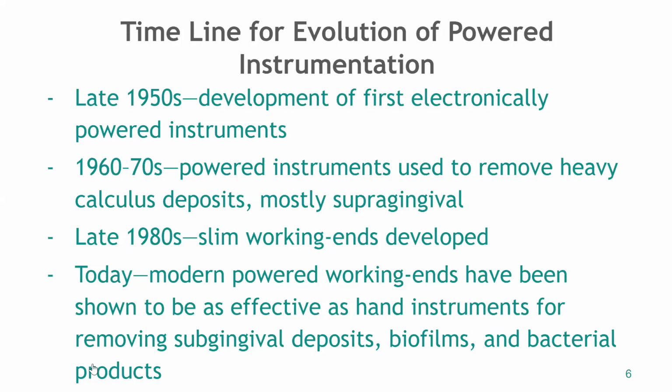You can't only use powered instrumentation. It's something that's used in conjunction with hand scaling, always, always, always. So it's going to be typically our first line of action, to remove large debris, and it's also going to be used greatly for deplaquing. It's just a lot more effective time-wise.